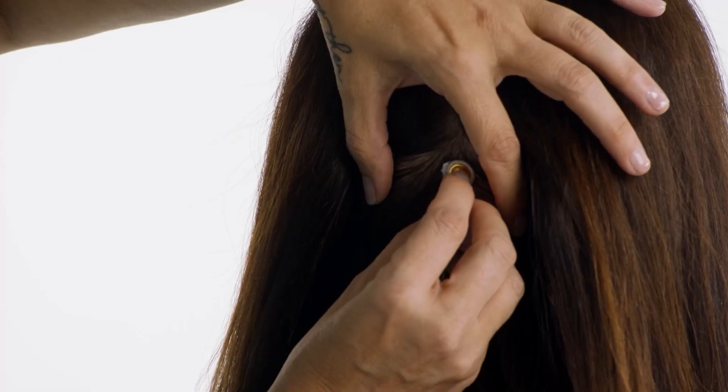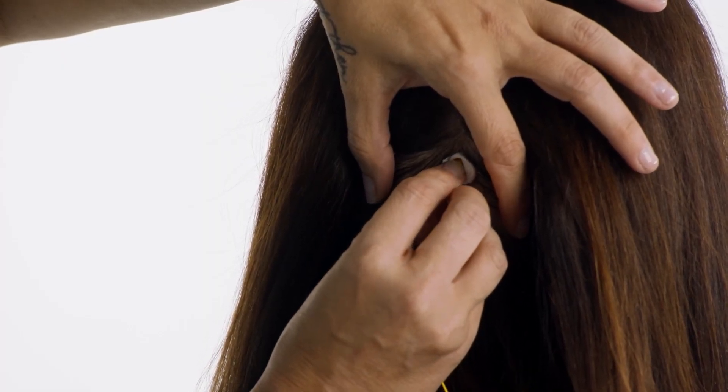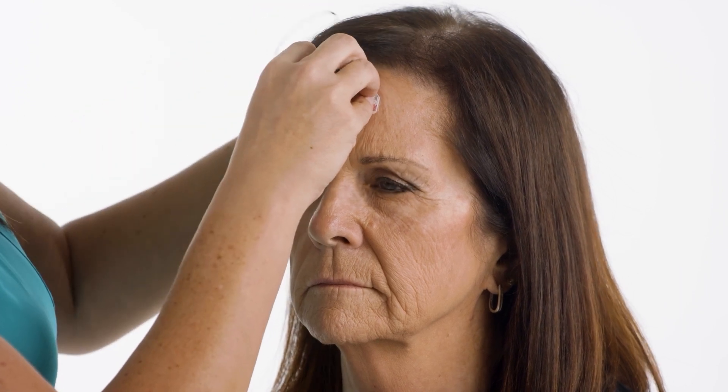The gold cup recording electrode will be attached to the scalp on the back of the patient's head. Clean the patient's forehead and place one of the disposable electrodes on it. You'll then attach the circular black cable, which is your negative ground cable, to this electrode.